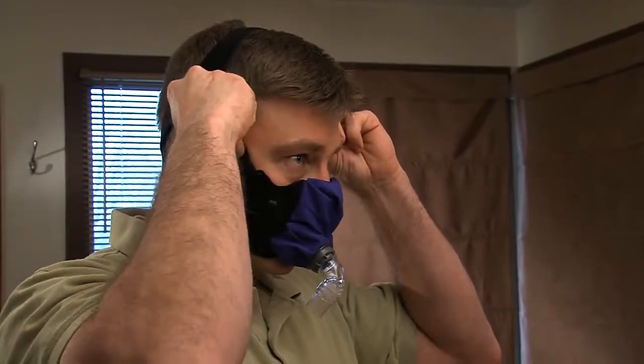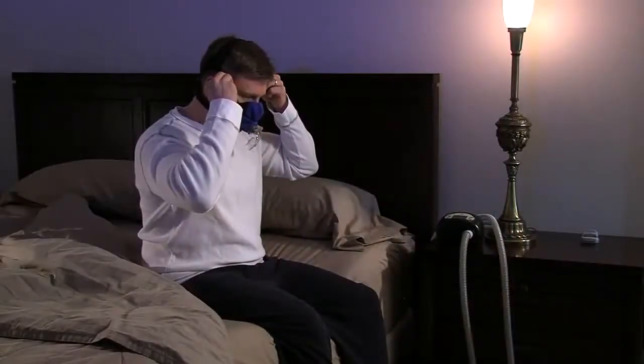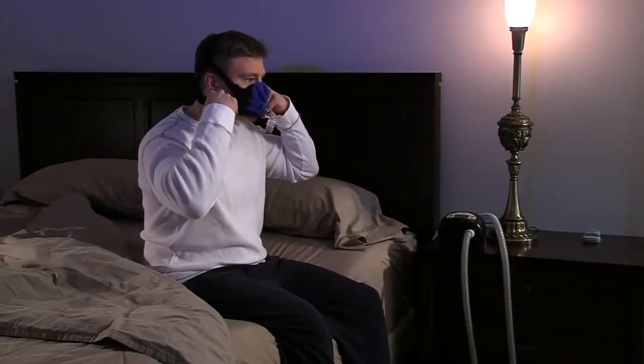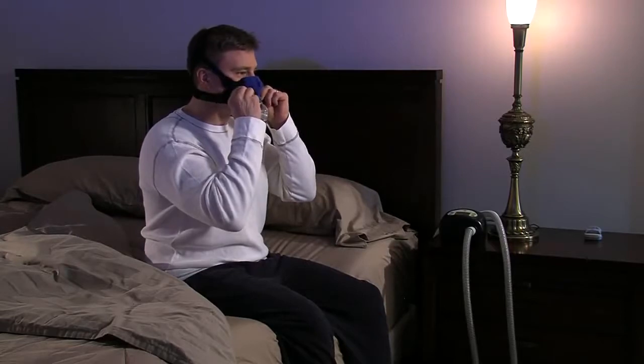Adjust the top straps first so that the nasal interface of the mask is comfortably resting on your upper lip. Adjust the bottom straps so that the oral interface of the mask is comfortably in place. Note: it is helpful to slightly stick your lips out when tightening the bottom straps to ensure that the fabric is going around the lips and not over them.